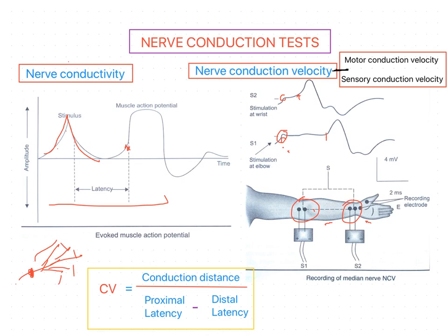So to show the latency, this graph is magnified here. The latency is measured in milliseconds from the stimulus artifact to the onset of the M wave.